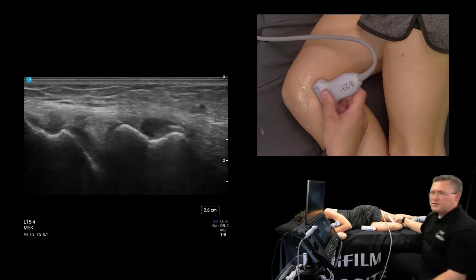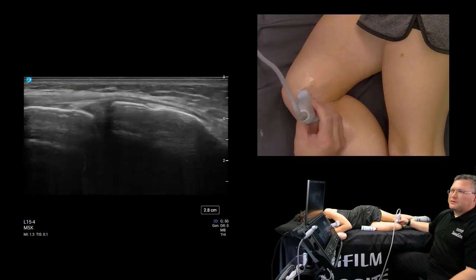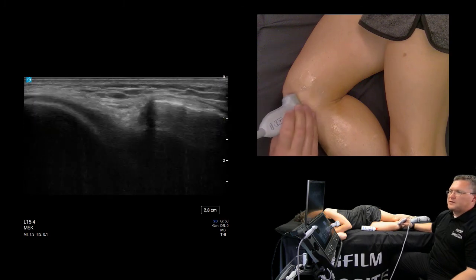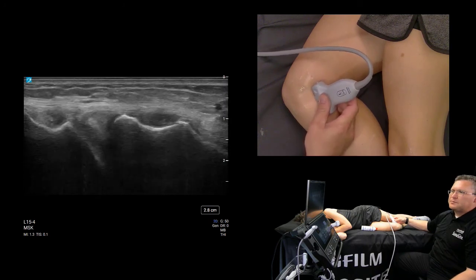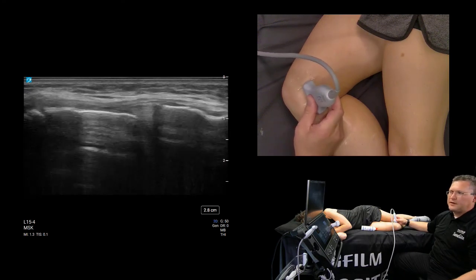And in the posterior knee, we'll look at the posterior medial and lateral meniscal margins to identify some other anatomy in that area. But it's a fun challenge to chase down the meniscus, but not a requirement in knee ultrasound. It is neat to image, but not part of a checklist or protocol to rule anything out diagnostically.